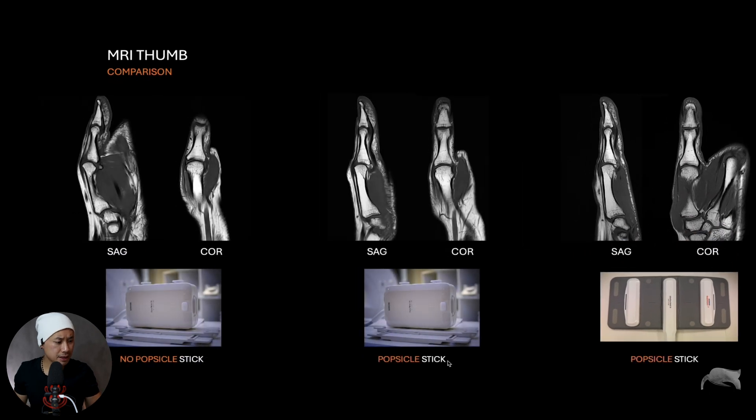Let's compare those three methods. This first one was done without the popsicle stick — you can see the thumb is a little bit bent. This one was done with the popsicle stick inside the hand-wrist 16-channel coil. And this one was the ultraflex small 18-channel coil. You can compare them directly. This is just a very cheap method to straighten out the thumb and get much easier thumb imaging.